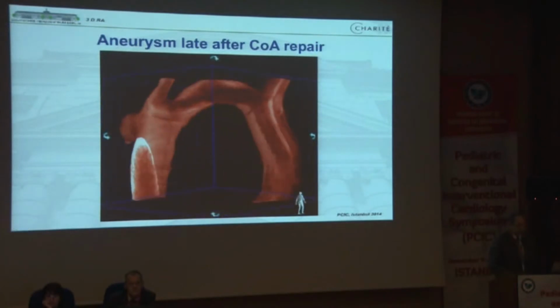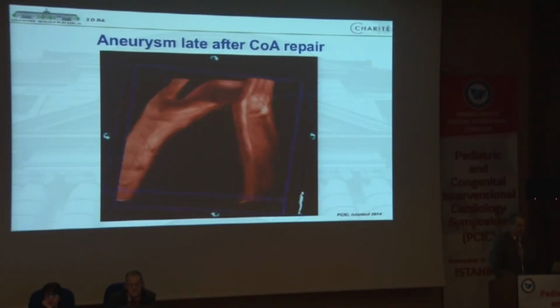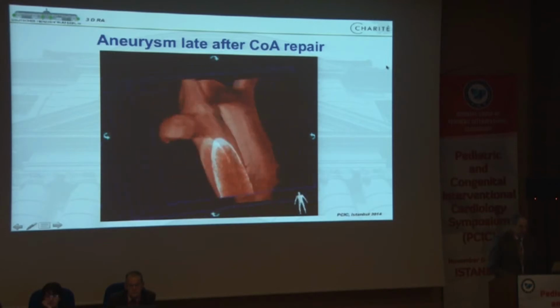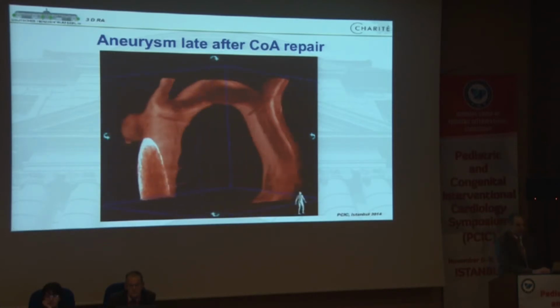This is another spatial information of an aneurysm, another patient with an aneurysm after surgical coarctation repair, to plan and to measure which kind of stent, how long the stent should be, and where you have to start with the stent implantation in any way.